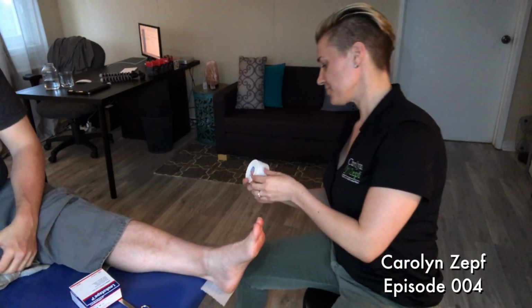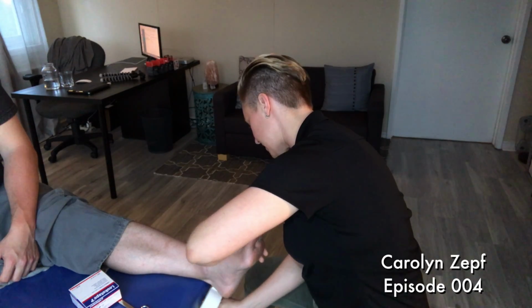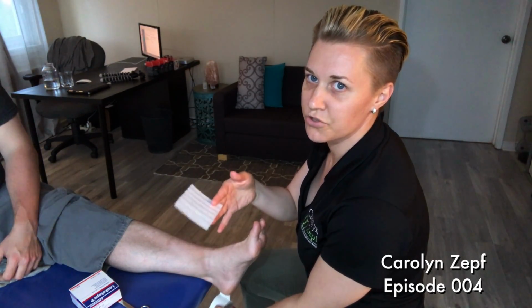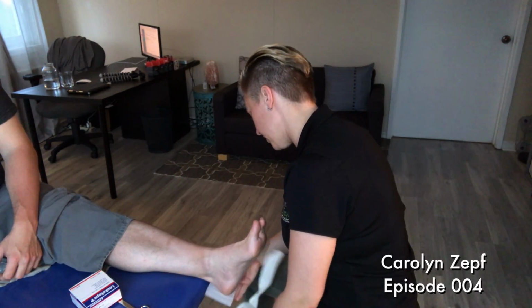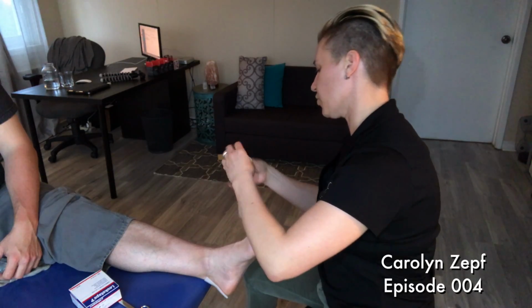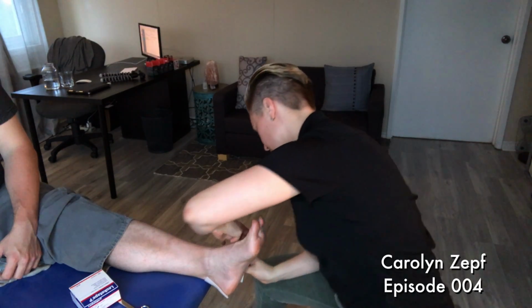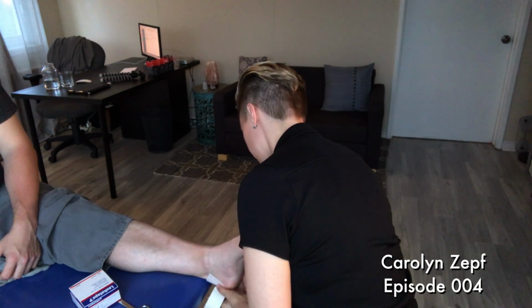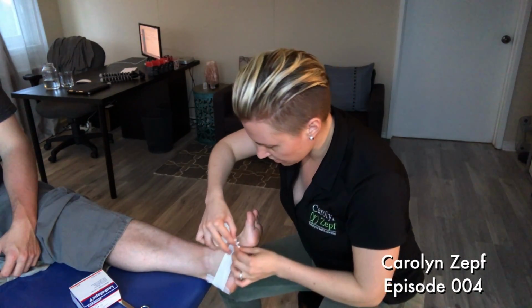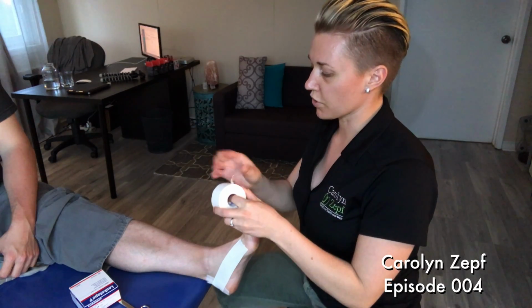Thanks, Brandon. The tape we're using is a white medical tape or a zinc oxide tape. Sometimes the heel and lace pads, especially if you don't have anything on, can drop off. It's good to use some Vaseline or something at the back. And we're just going to start again just because the tape rolls there. So flex your foot up. You're just going to do one strip around the outside of the foot, ending at the inside. It's just an anchor strip to allow you to visualize where your strips are going to go.